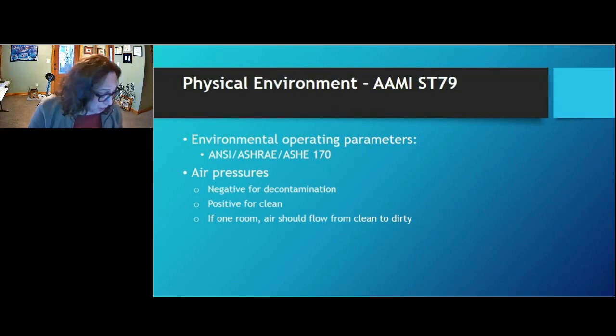I'm going to spend a minute or two talking about the physical environment. This is from AAMI ST79, which I had mentioned earlier. A lot of times I'm asked, well, what about temperature? What about humidity? Do they matter? What about pressures? What about ventilation? Does all that matter? Yes, it does.